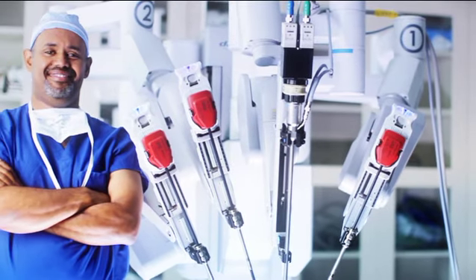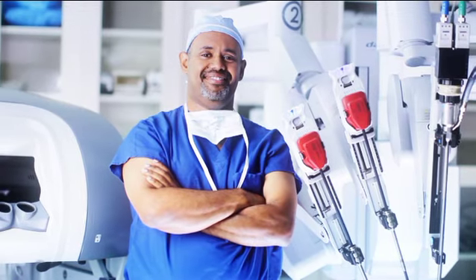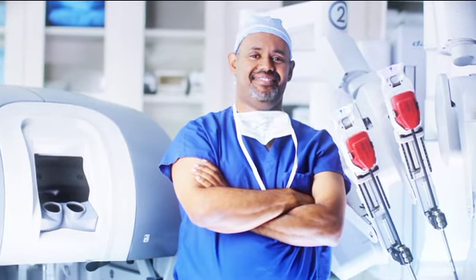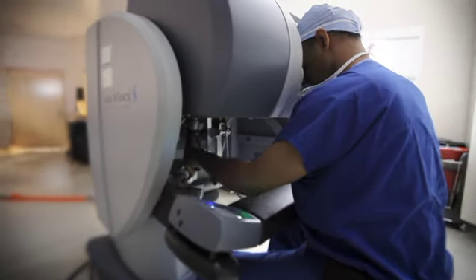At FAMC, we're proud to have on our staff one of the most experienced surgeons in the Midwest, Dr. Paulos Johannes, urologist. He has performed hundreds of procedures to remove cancerous prostates using the da Vinci.